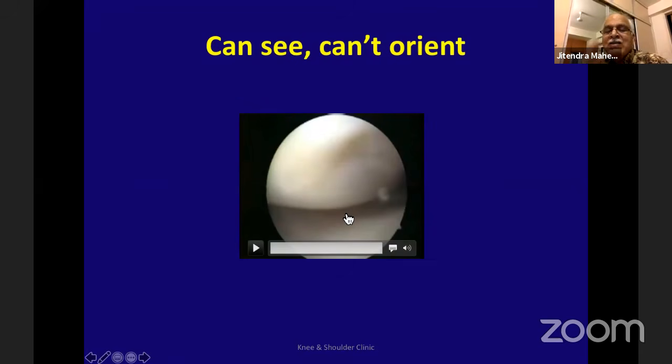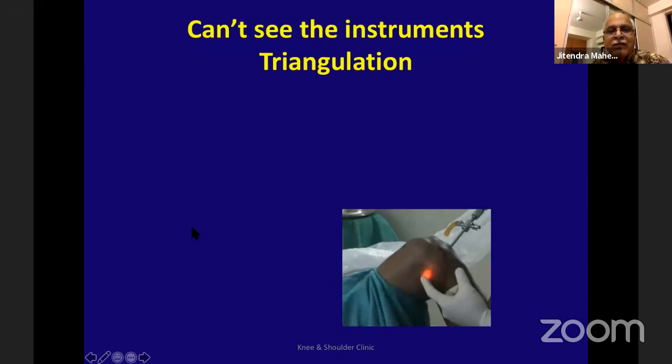So if I open up the knee, this is what I'm going to see. If my camera and my light source are in the proper direction, I'll see exactly what I'll see if I do an arthrotomy in that area. So that is one point to orient yourself.